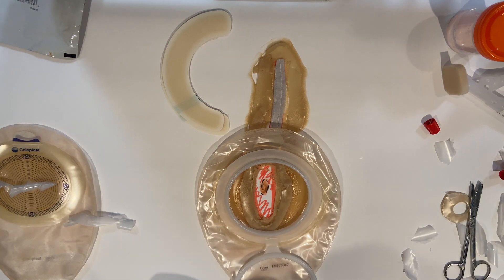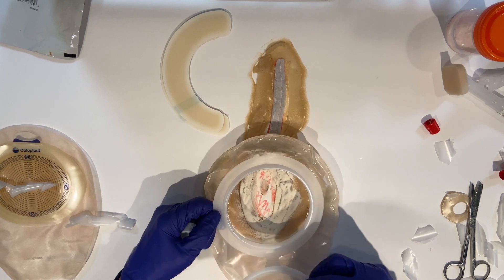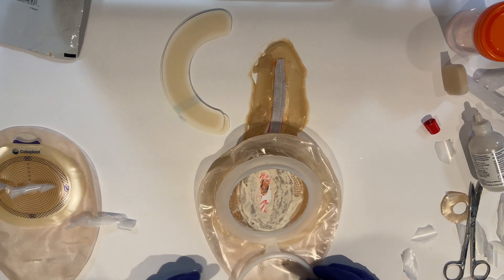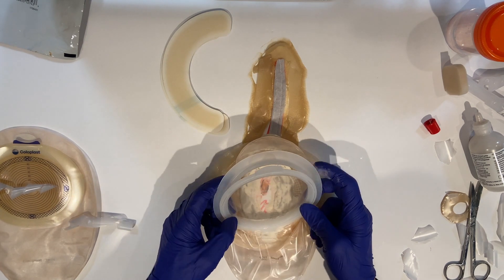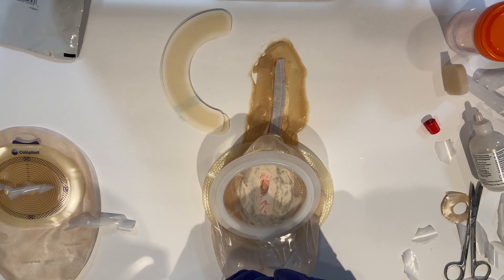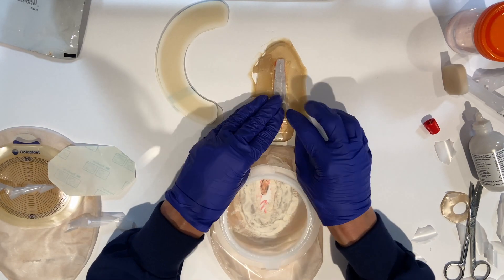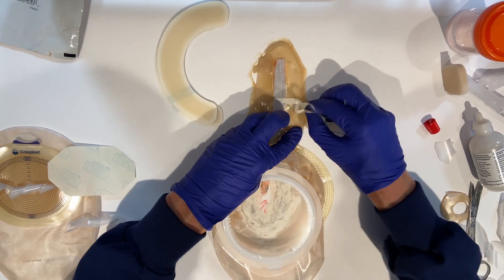Then my favorite part — powder. The powder can go on the fistula, it's going to be fine. You just want to have enough on there so the pouch lid doesn't stick, and also to address all those little micro leaks especially right down at the base. Then remember this pouch in particular is not a Tupperware top — it's a top that stretches around and on top. Click. And don't ever forget to do that, because it makes people angry. To finish the rest of this, you can use clear dressing right up and over the top — that's going to be comfortable for the patient and you'll be able to watch your silver dressing to make sure everything's going well.